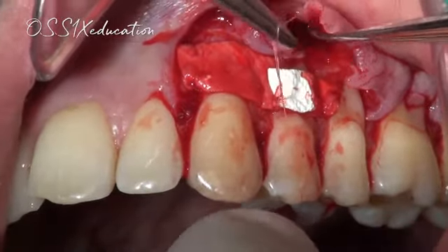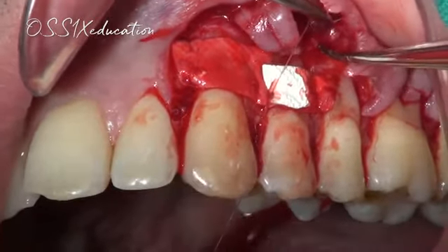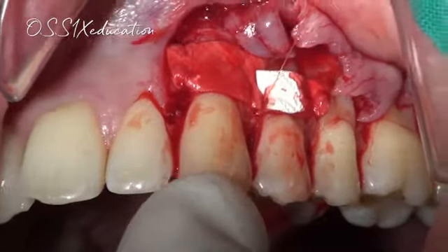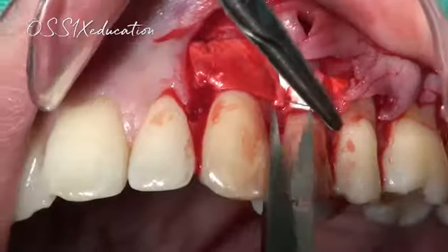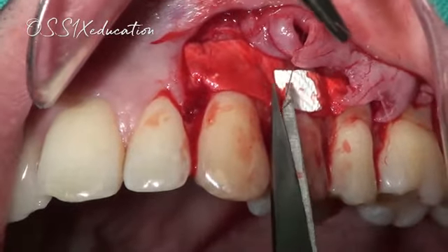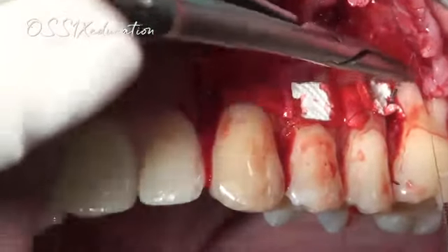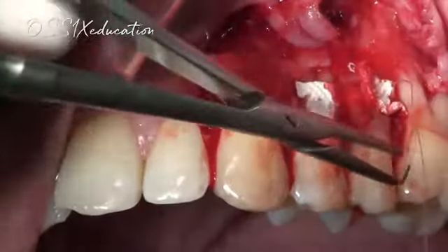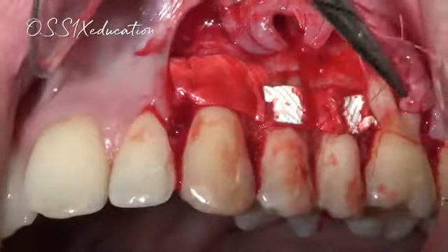and to support the flap, because it is a scaffold, it is not a living tissue, so it takes time for this material to turn into the tissue. It takes around 2 weeks for this scaffold to vascularize, which is quite good. And this is nice.